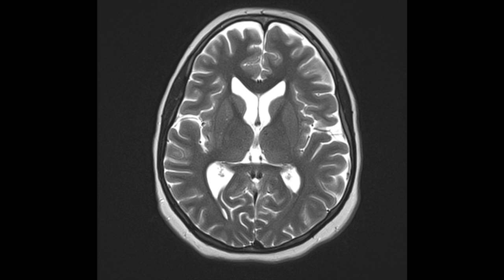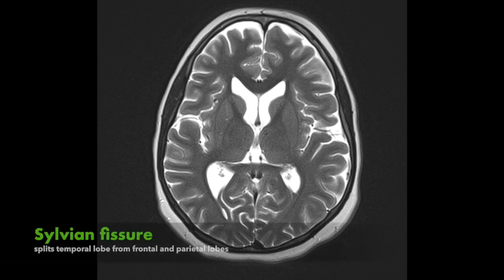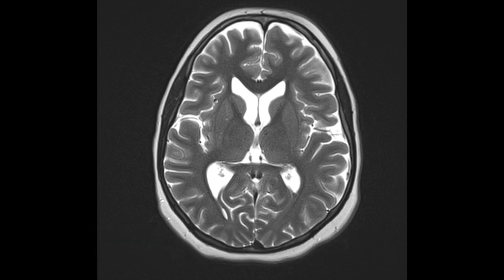Here we can see a fissure called the Sylvian fissure, which separates the temporal lobe inferiorly from the frontal and parietal lobes superiorly.